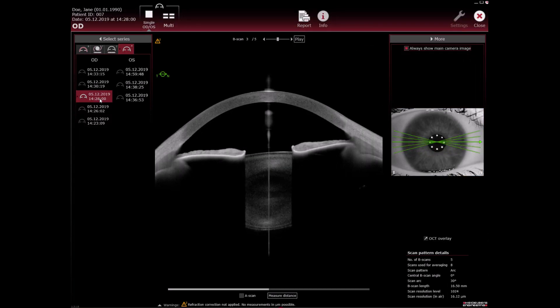To display the IR image associated to the selected OCT image, clear the always show main camera image checkbox.